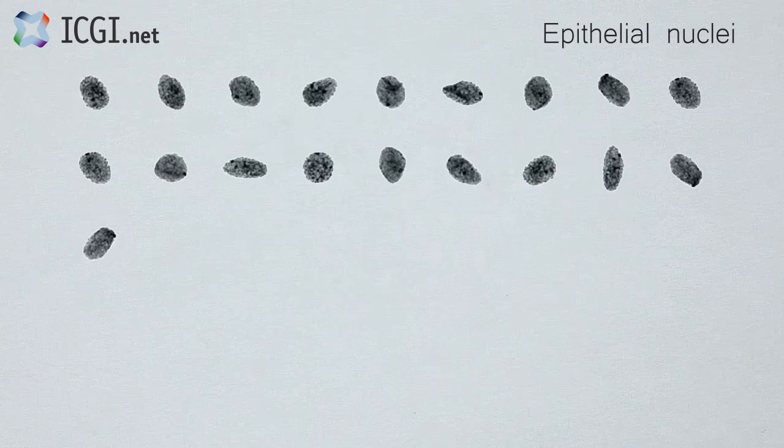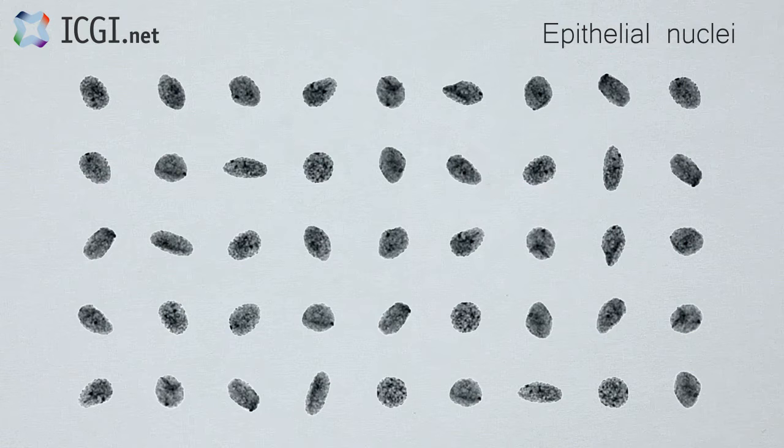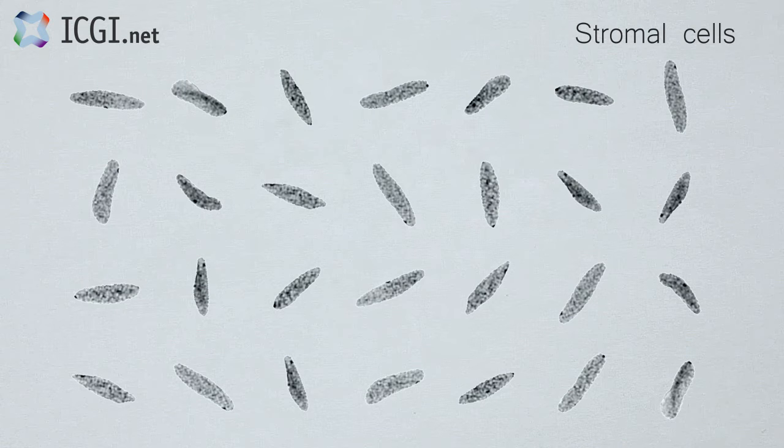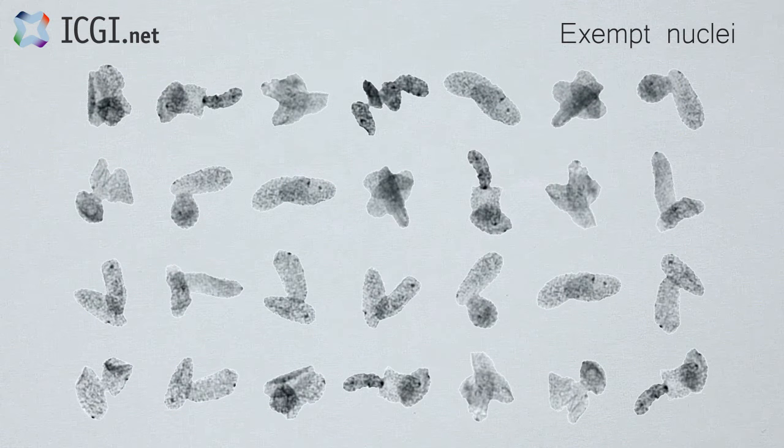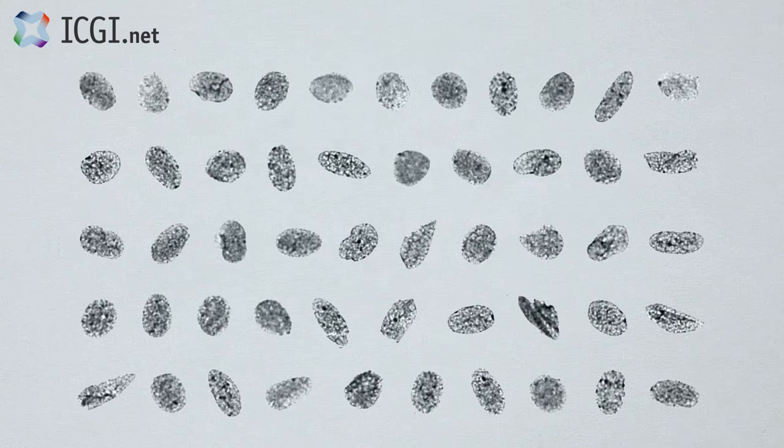PWS Grabber algorithms automatically assign nuclei candidates to one of 5 categories: epithelial nuclei, lymphocytes, plasma cells, stromal cells, and exempt nuclei. These groups are sorted into galleries designed to be viewed in PWS Classifier.